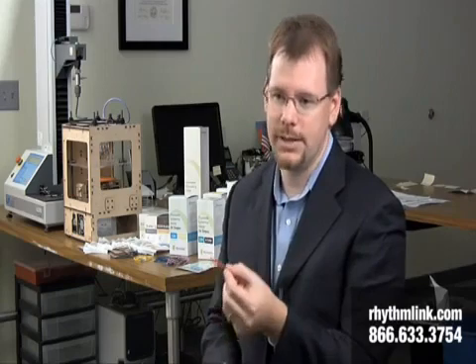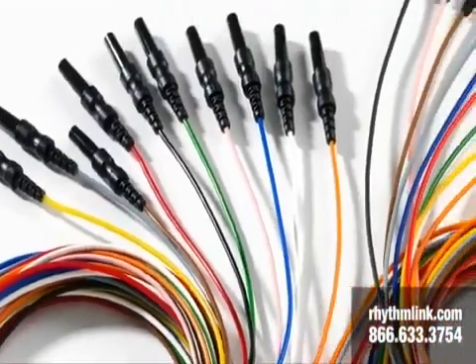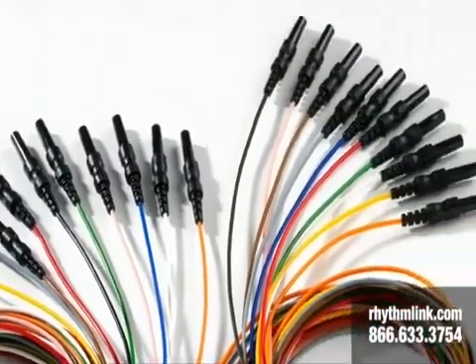The lead wires terminate into what's called a DIN 4282 touch-proof connector. That means somebody can't plug this into a wall socket and electrocute themselves, because the inside of this is touch-proof. It's a safety feature.